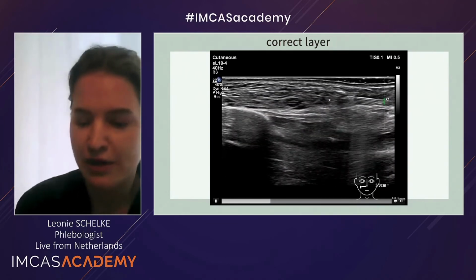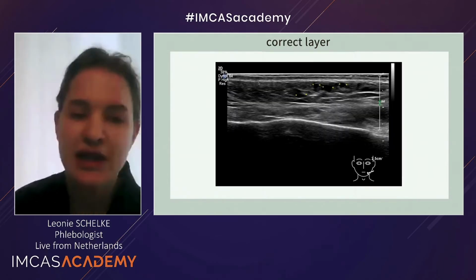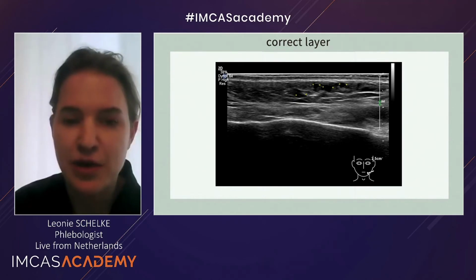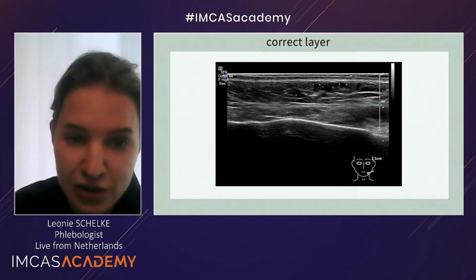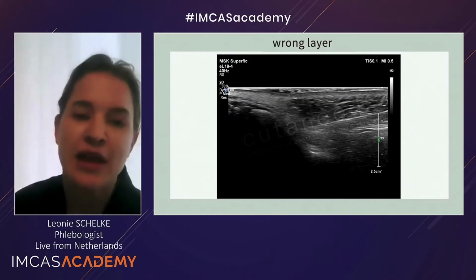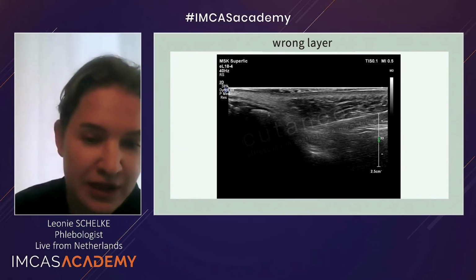And if you look afterwards with ultrasound, this is the subcutaneous layer, the SMAS, and here are the hyaluronic acid deposits placed correctly under the dermis and the epidermal layer. But here my cannula glides without any problem. It goes into the fascia blades, and we do see this a lot at our polyclinic.